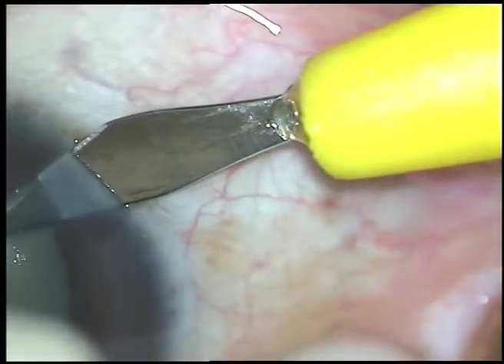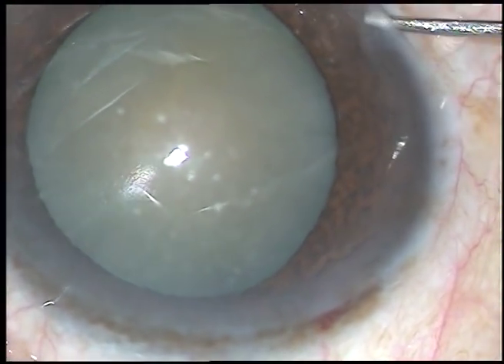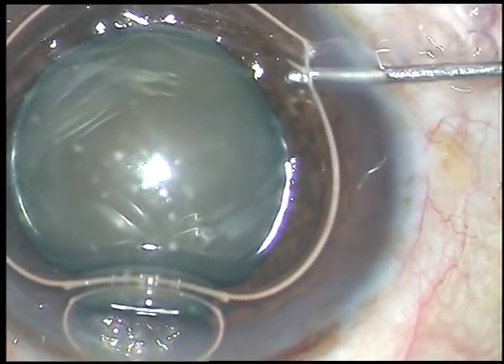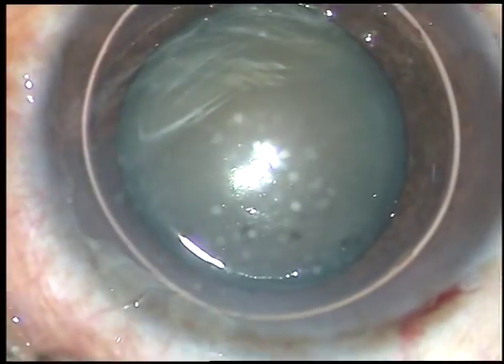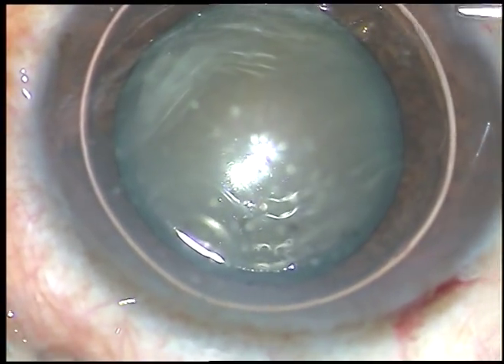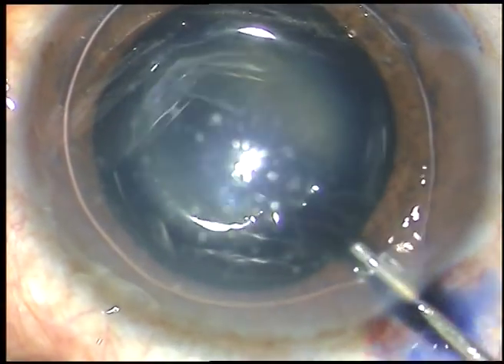Now this is a side port about 3 o'clock away from the main incision on the right side. Now I am injecting an air bubble. I want to stain the anterior capsule of this cataract with trypan blue dye, and here goes the 0.06% trypan blue dye.